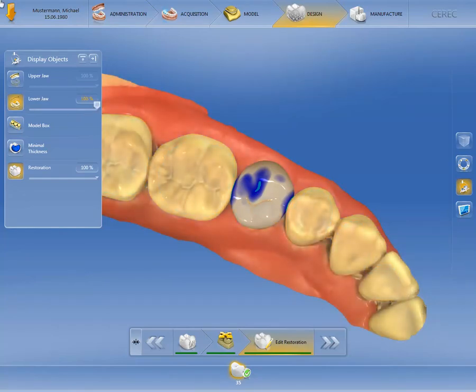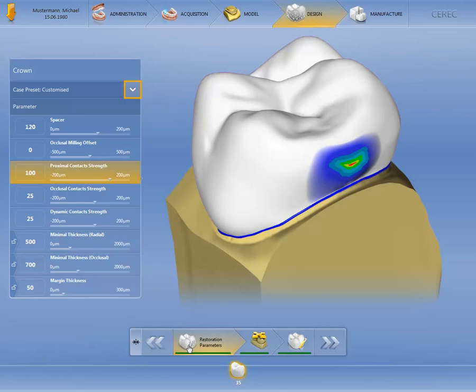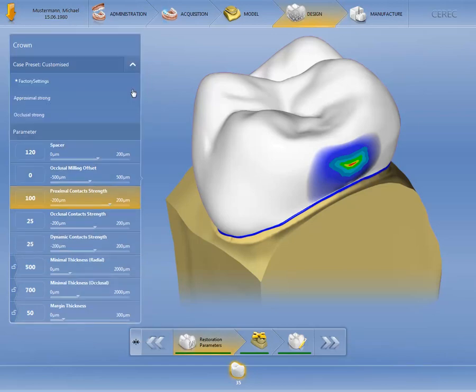Let's suppose that you want to use one of your previously created profiles for this restoration. To do this, we need to close the display objects area and go back to the restoration parameters in the step menu. The individually created profiles are shown by activating the checkbox under Presets. Let's select the occlusal strong profile. After confirming our selection, the CEREC software calculates a new restoration suggestion.